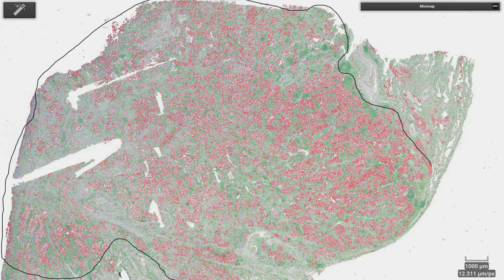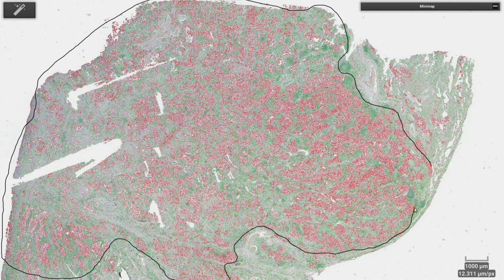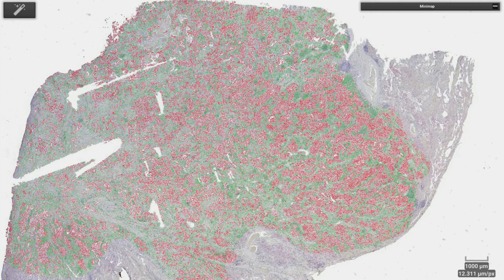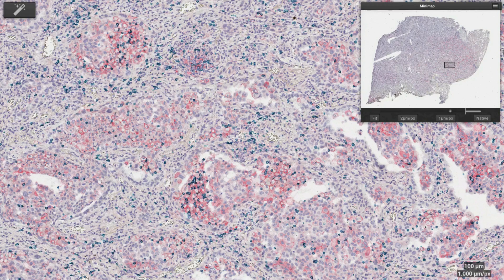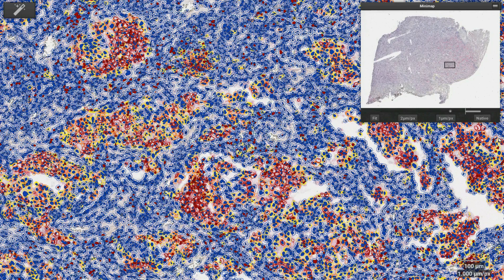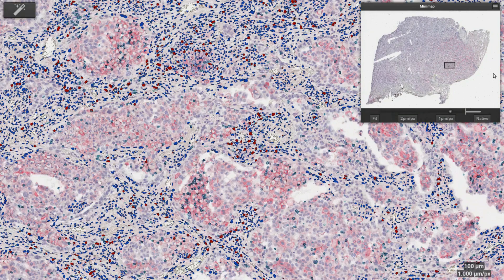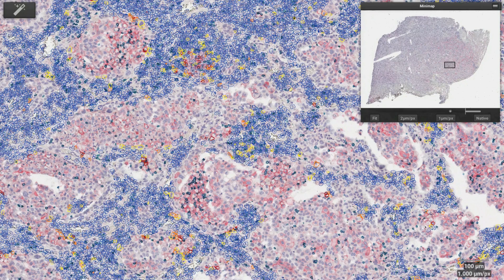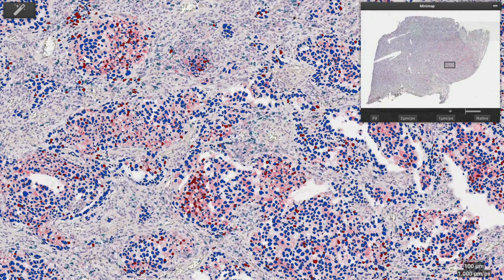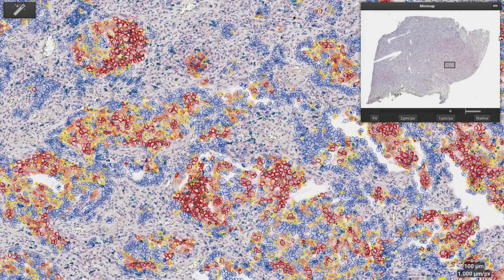The importance of whole-slide analysis becomes clear when looking at the heterogeneity across the slide. But whole-slide analysis does not mean analyzing the whole slide — the pathologists need to identify the right region for the analysis: the tumor with its tumor microenvironment. Here we discard 20% of all cells. Our biofeatures include the quantification of the stains — here we show CD8 in the tumor microenvironment, now PD-L1, and here CD8 in the tumor, now PD-L1.